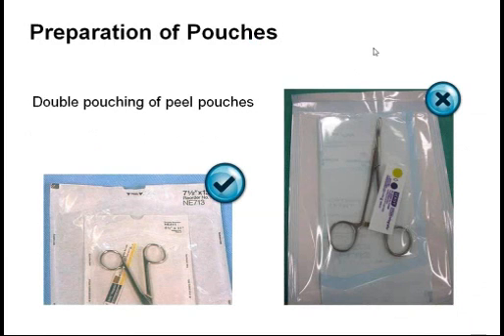Double pouching instruments with an oversized inner pouch can cause challenges with air removal, sterilant contact, and drying. When an item is double packed, two sequentially sized pouches should be used. The sealed inner pouch should fit inside the outer pouch without folding. The pouches should be positioned so that the plastic faces plastic and paper faces paper.